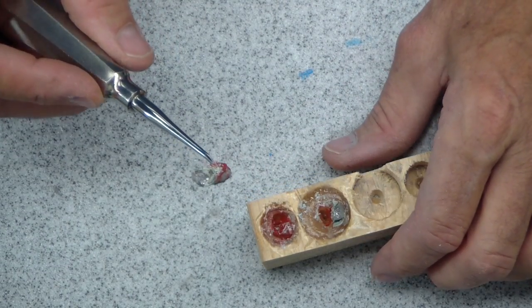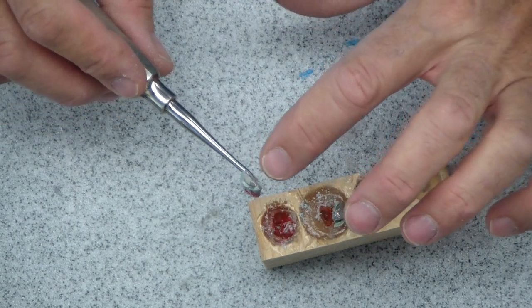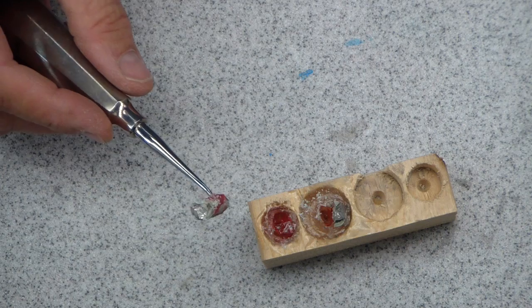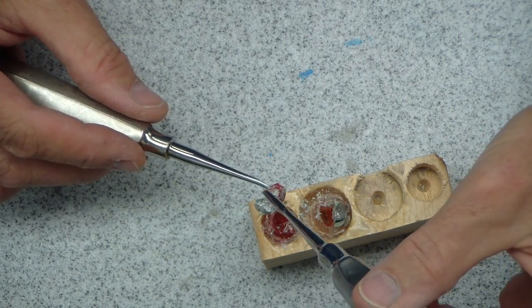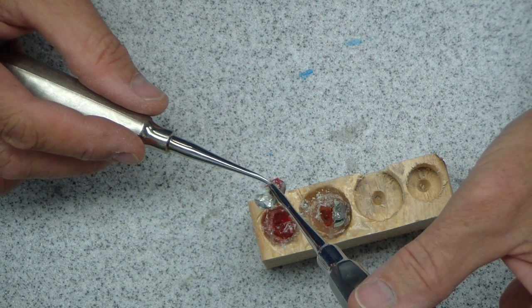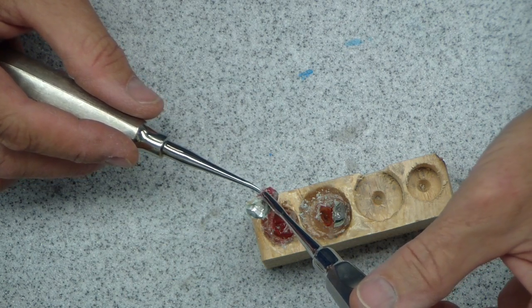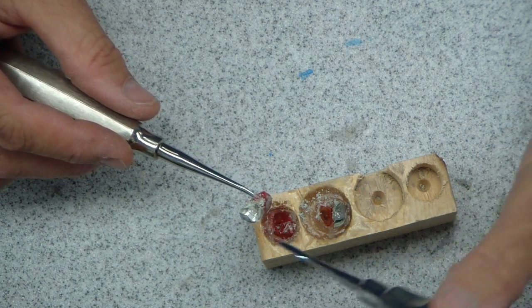That's what you want. You want it to come out in one half, go down through the middle there, almost to the furca. I probably went a little further than normal and a little wider at the top so that when you go in with your Cogswell A, you don't want the Cogswell A to bind up here. You want it to bind down here, so you're putting pressure down at the furca, not at the top of the crown there.